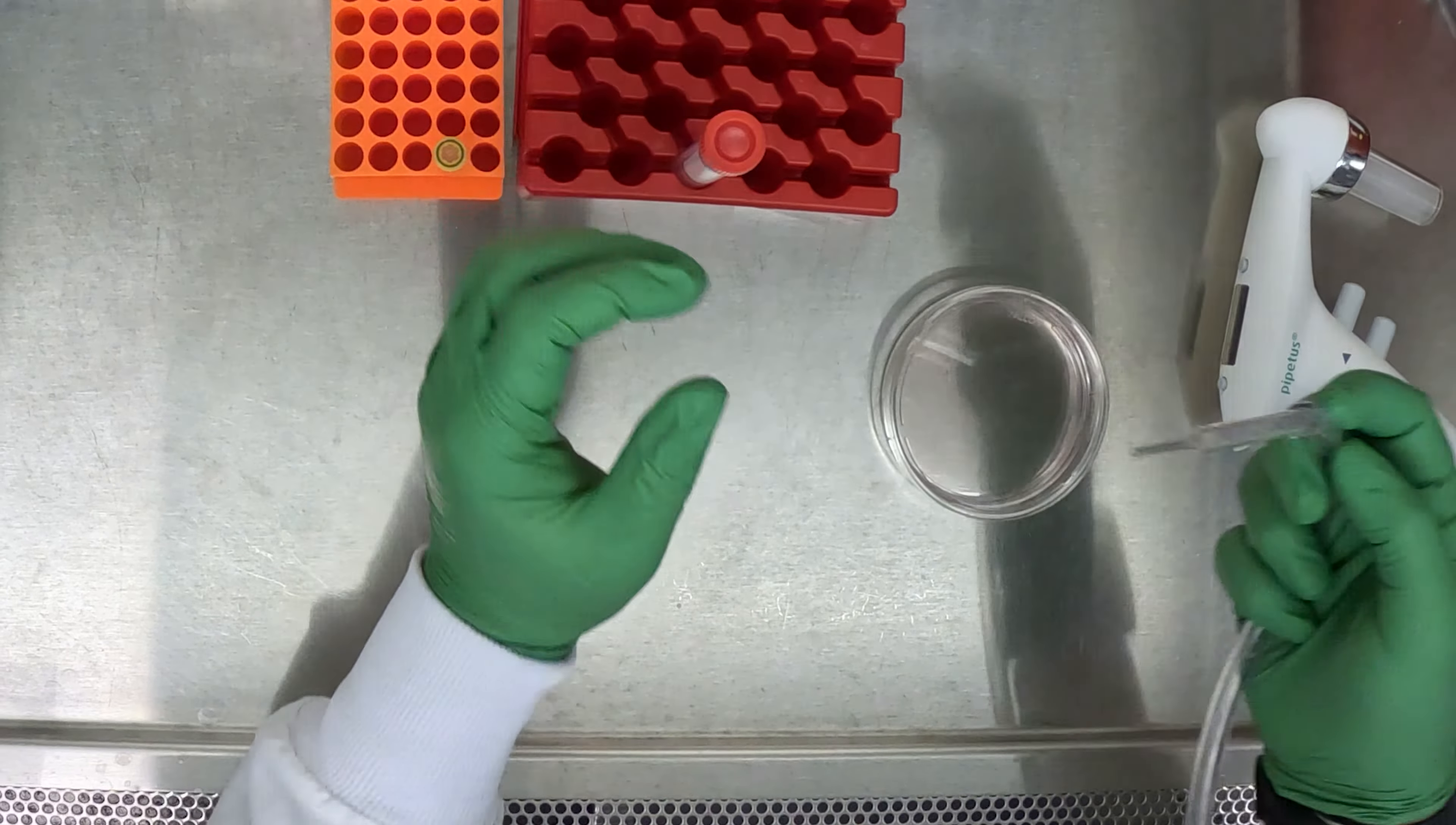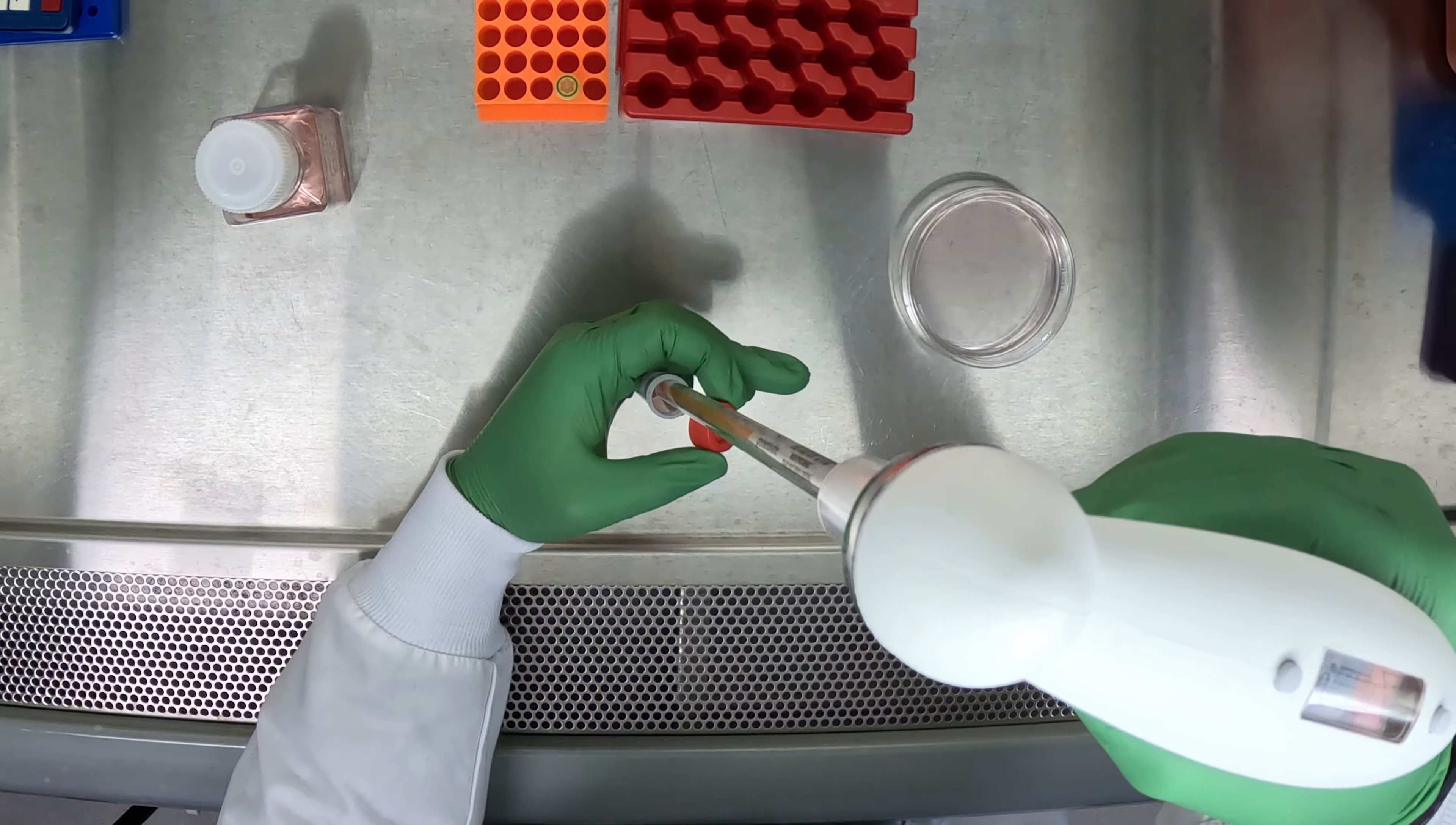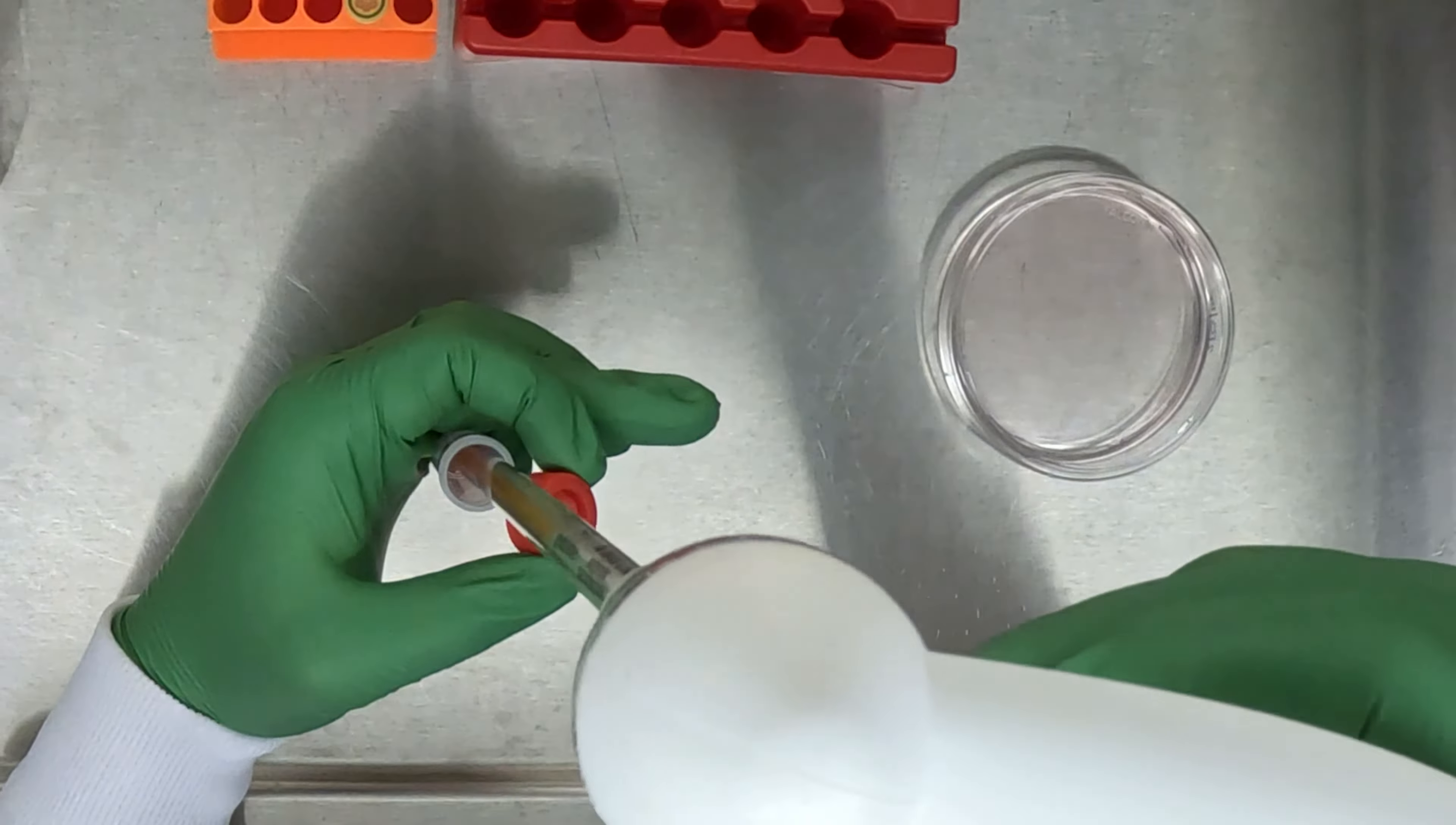Once we have aspirated off the supernatant, we will now resuspend our cell pellet in 5ml of M-Teaser plus rock inhibitor media. After adding the 5ml of rock inhibitor media to your cell pellet, gently resuspend the cells by triturating up and down three times, trying to avoid bubbles if possible. After resuspending your cells in the 5ml of fresh M-Teaser plus rock inhibitor media, transfer the entire volume to your prepared recovery plate.